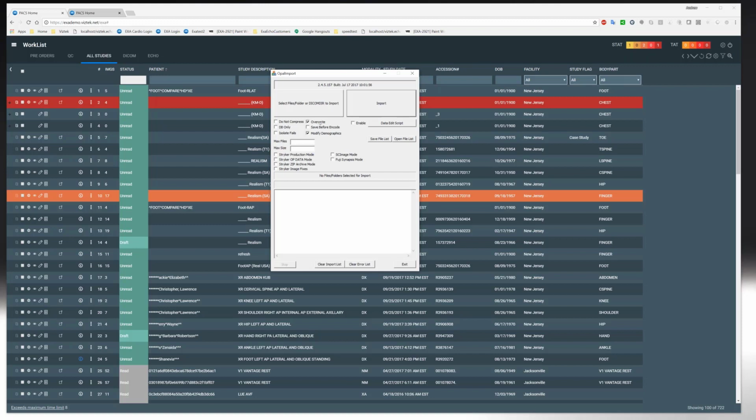These functions are related to that same idea that this is a workflow system that increases speed and efficiency across all manufacturers, across all different kinds of workflows, and across different institutions, since it's often the case that we're going to get a disk, perhaps, from some other manufacturer than we're used to seeing in the hospital, and it's going to have a different patient ID scheme, and I can make it match up to what's already in the database as I import it.